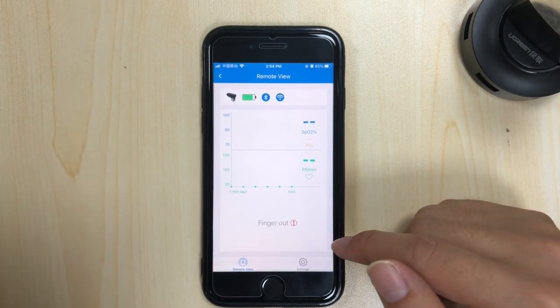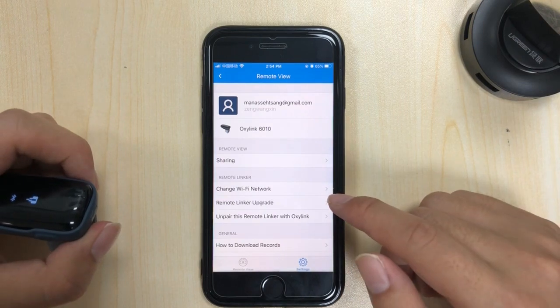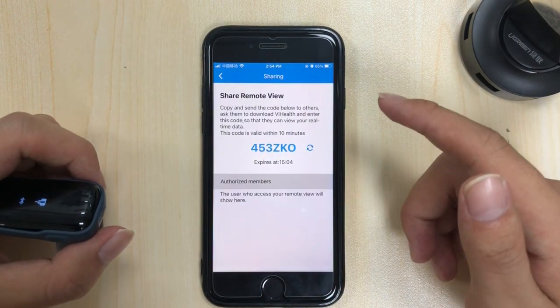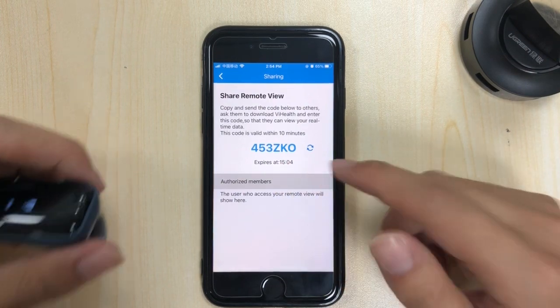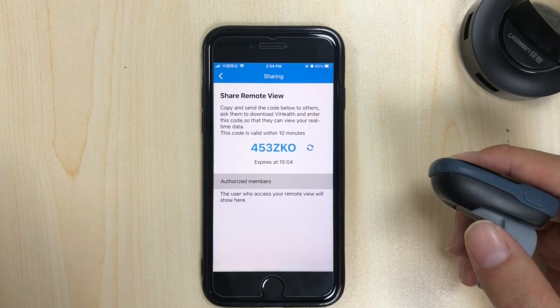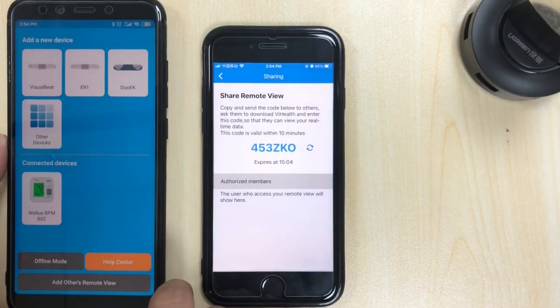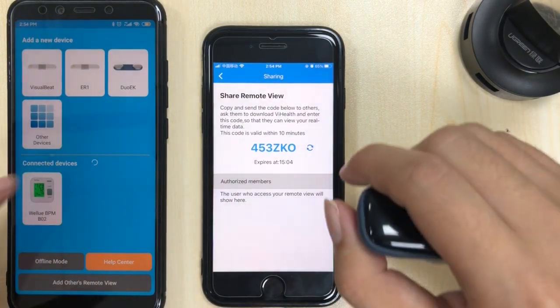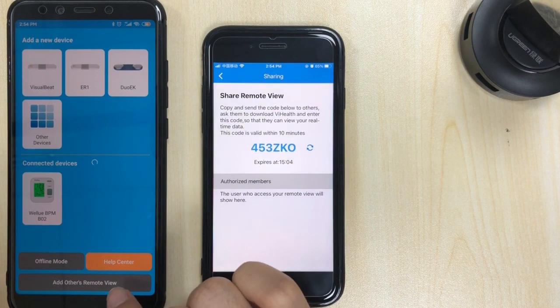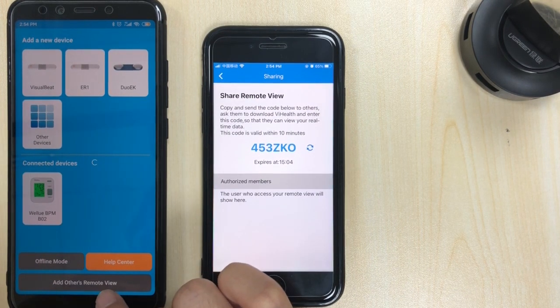Next step, we're going to share the code. Tap 'Remote View' then 'Share' — we now have a code. On the second phone, run the app and tap 'Add Others' then 'Remote View'.